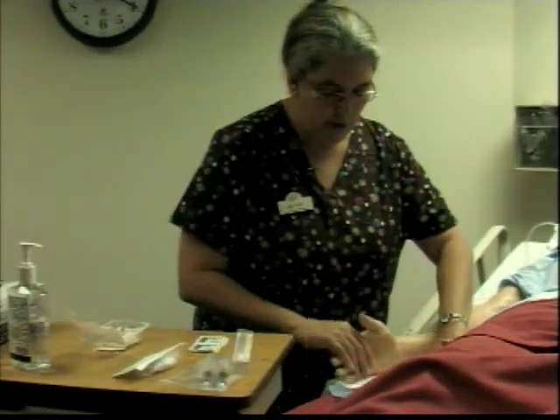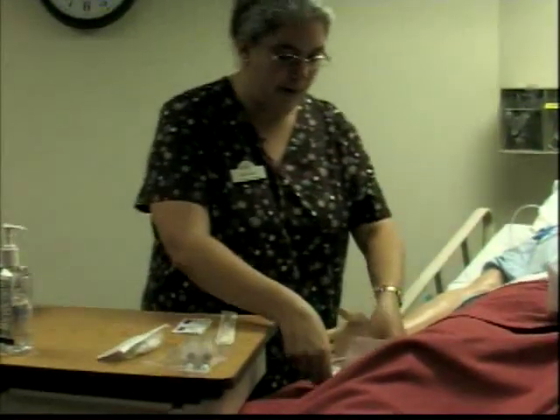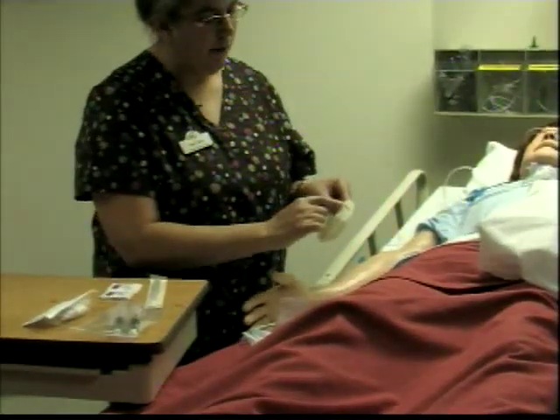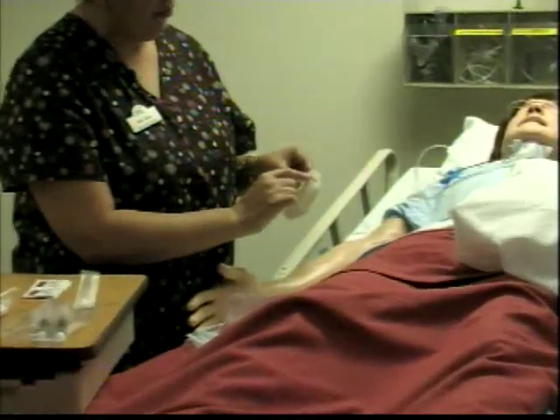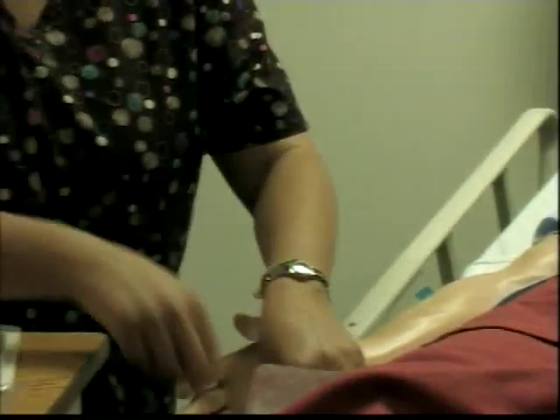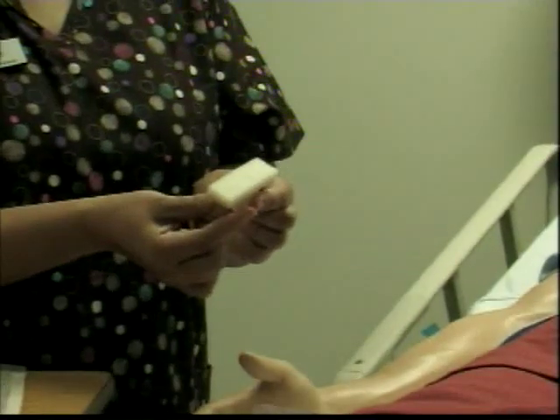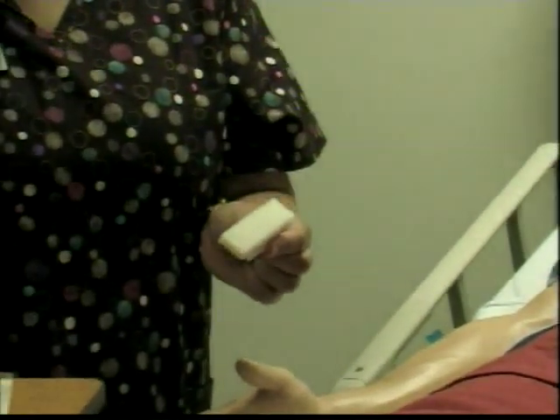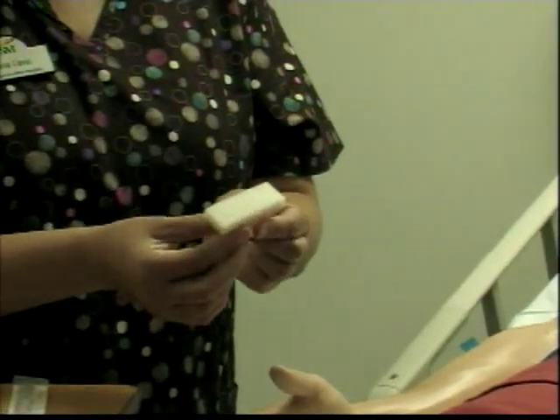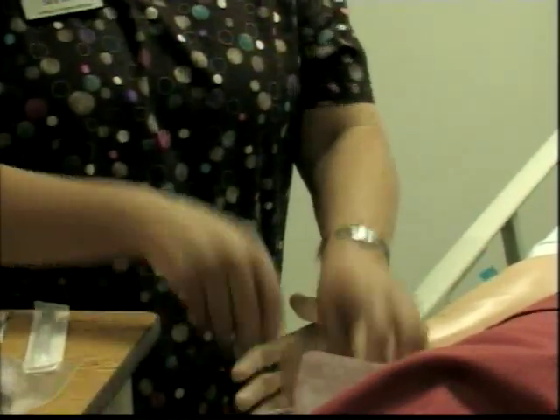So I will put everything on the patient's bed right on top of the blue chux, so you have it available. This is your Tegaderm. The Tegaderm is going to have a little part where you will put your date, your time, and your initials, and you'll peel that off and put it on the side, and I'll show you that in a minute. It has the supply that they will give you to clean. Before, we used alcohol pads; now we actually have something that is less irritant to the skin, and it is only one, so you'll be using a circular motion and you'll see that when I perform it. You have extra gauzes in here.